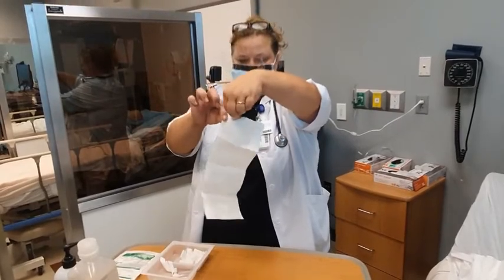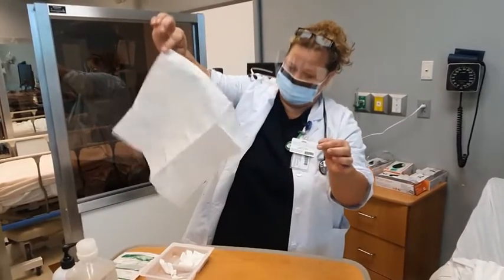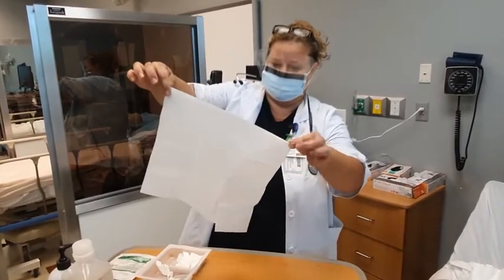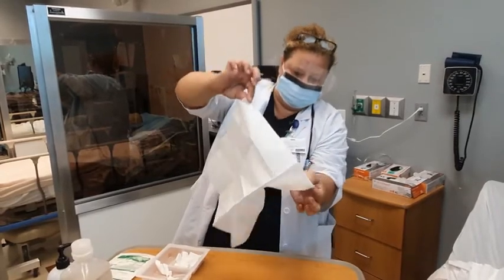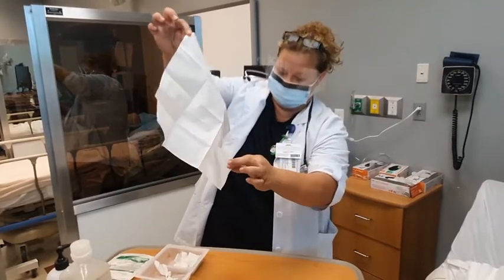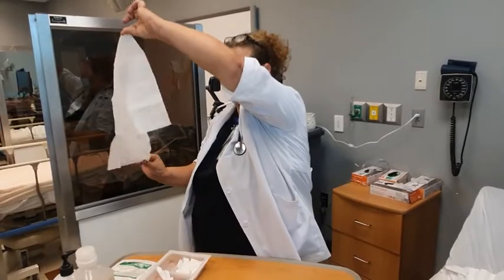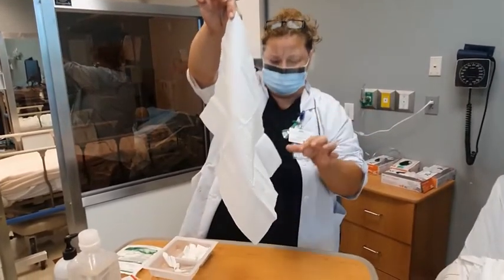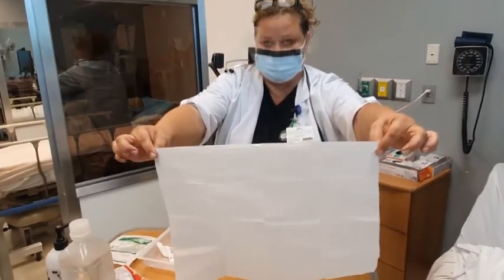Then you grab the other corner here. And you keep going. Now, as you can see, when you're looking at this, you're able to touch the outside still here. And the corner doesn't want to come to me. There it is. Now, you see the shiny side is here. I'm showing you. And the flat side, of course, is on this other side. You want to take this and put the shiny side down on the table.